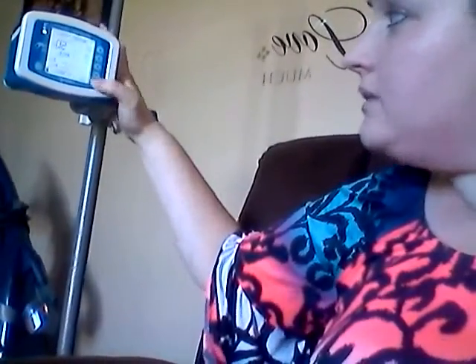You also can adjust the feed rate and the feed VTBD, which is the volume. And so anyway, that's pretty much it. And whenever you first turn it on, you've got to hold it down for 3 seconds to turn it on. But anyway, whenever you first turn it on, it'll pop up, you have the option to clear the settings or keep the settings.